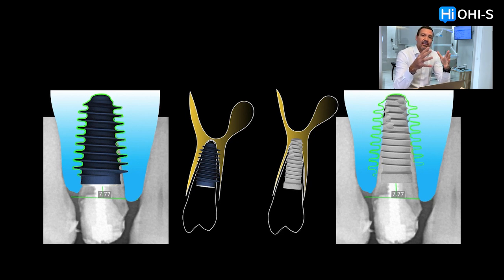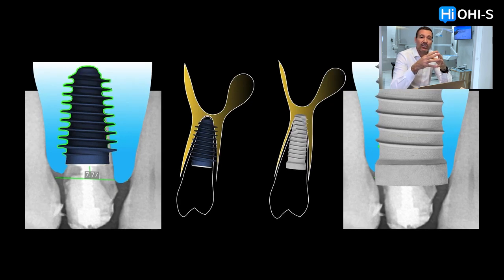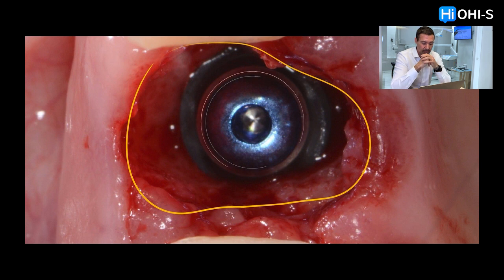The biomaterials are going to support our regeneration, especially in the gap at the socket placement, where some biomaterials are more prone to infection in cases of non-cooperation from the patient.